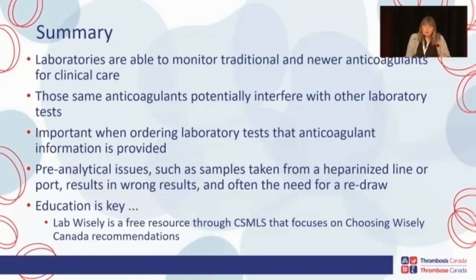But for instance, samples taken from a heparinized line or a port result in wrong results. End of sentence, okay? And we will need you to redraw or order a redraw. And education is key. There are resources out there, and we need to continue to dialogue with our labs and our clinical partners in order to share that.